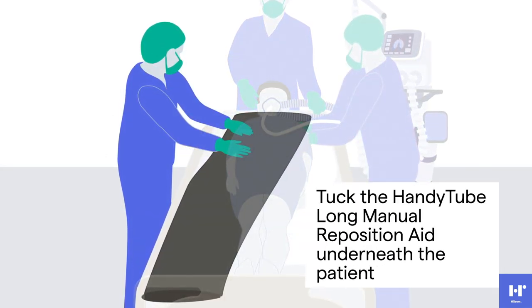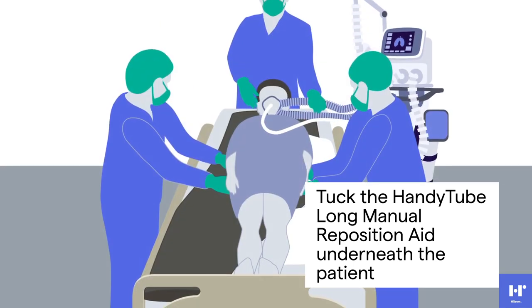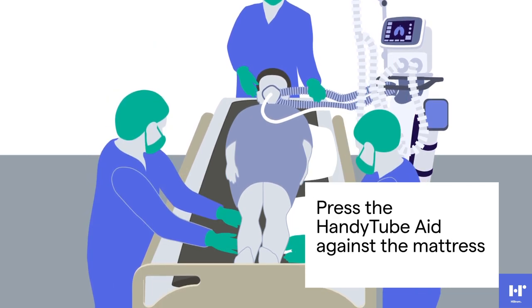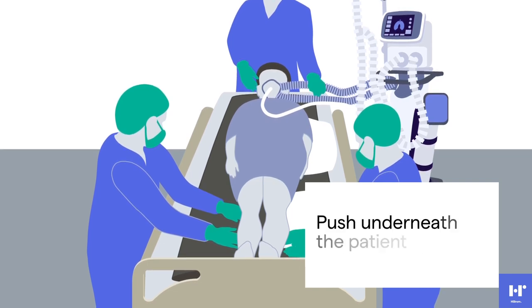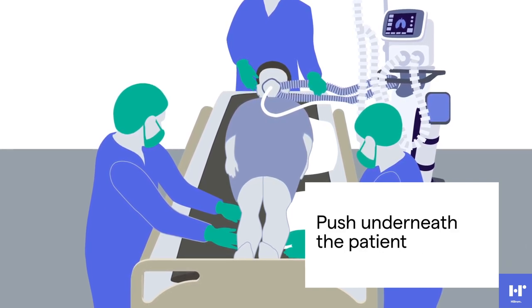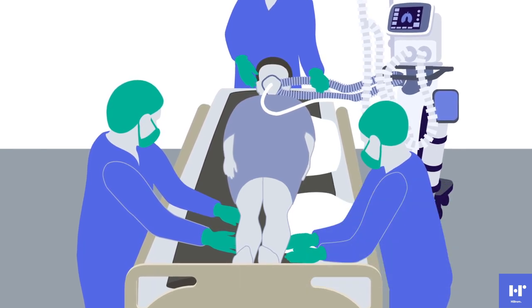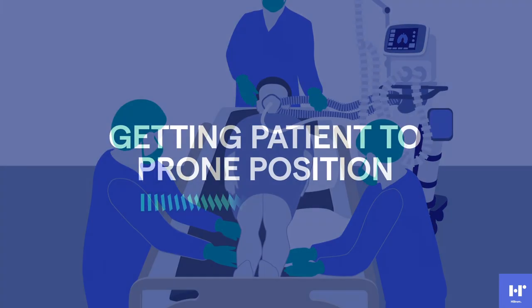The care team member on the right side of the patient will tuck the Handy Tube Long Manual Reposition Aid underneath the patient, being careful to include coverage from the shoulders to the heels. Press the handy tube down against the mattress at the same time that you slide it underneath the patient. Try to position the handy tube as far underneath the patient as possible. The handy tube prevents friction during the lateral transfer to the edge of the bed prior to turning the patient into prone position.